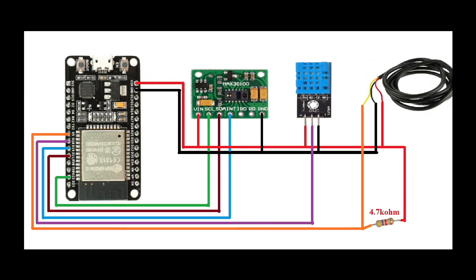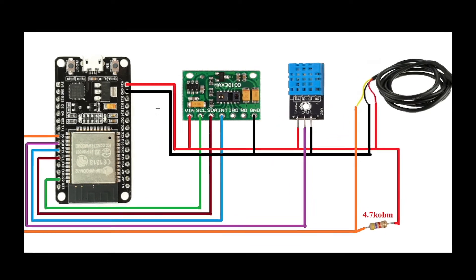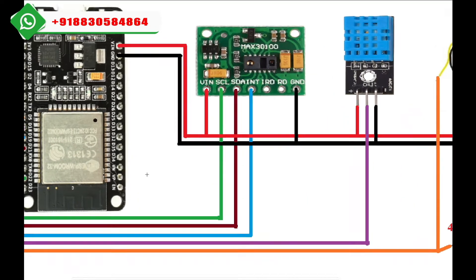Here I use the ESP32 module and MAX30100. The second sensor is the DHT11 sensor, and the third sensor is the DS18B20 digital temperature sensor. I connected the VCC and ground — VIN is the VCC — going to the MAX30100, the DHT11 positive terminal, and the DS18B20 positive terminal. The ground pin is connected to all ground pins.